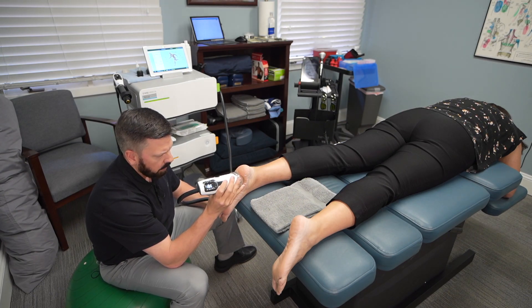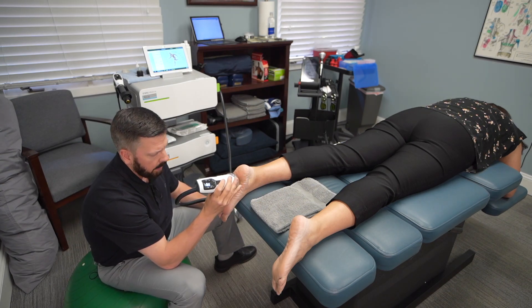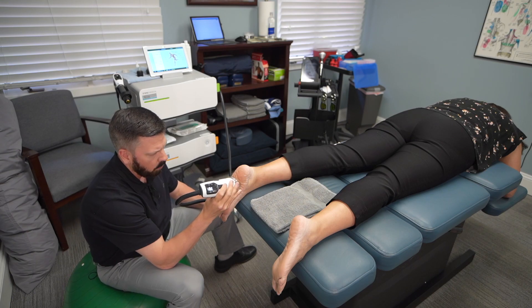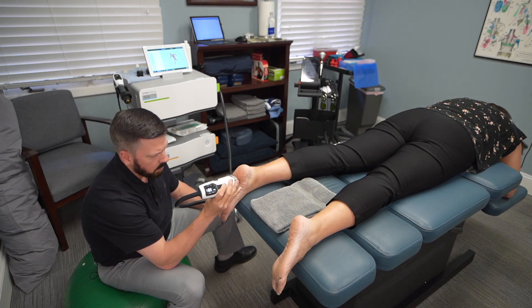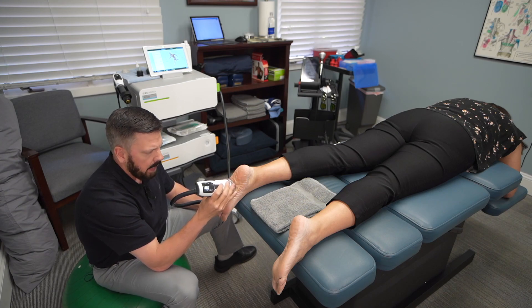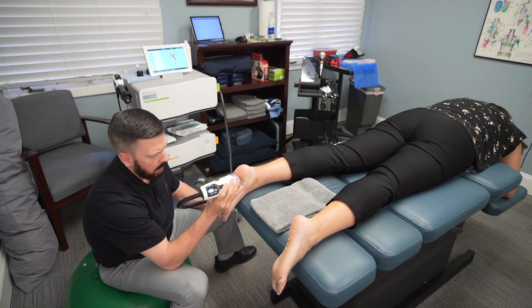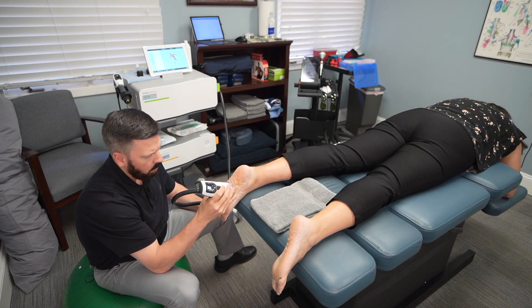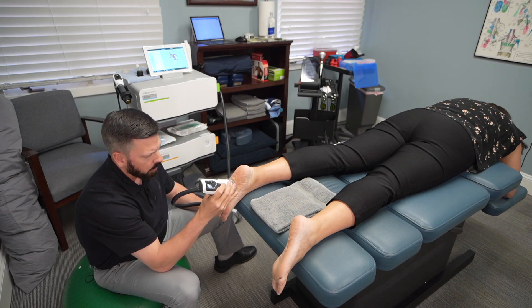We focus right at the calcaneus point and then work our way down into the arch. Not only is this therapeutic, it's also very diagnostic — it helps us determine exactly where the problem is. When we get over the actual treatment site it will feel like a deep ache, and when we're done treating it the patient immediately feels an improvement and reduction in pain. Patients can feel it working and then feel the results right afterwards.